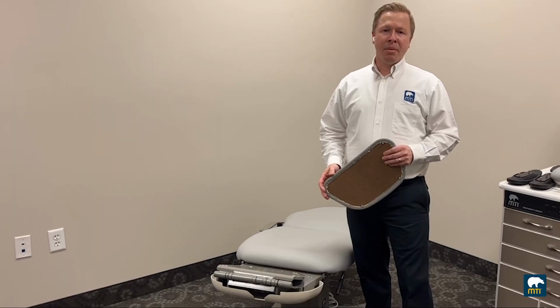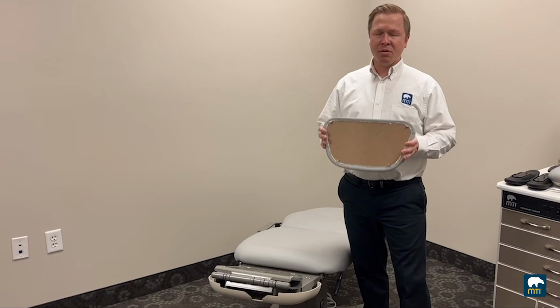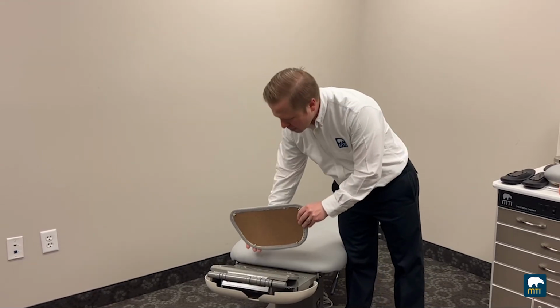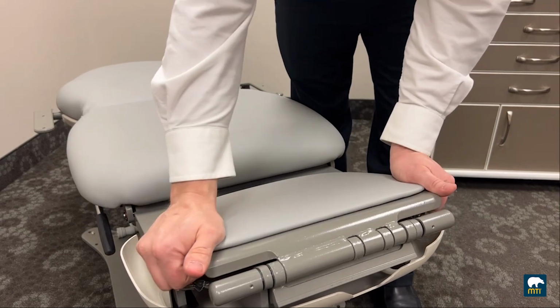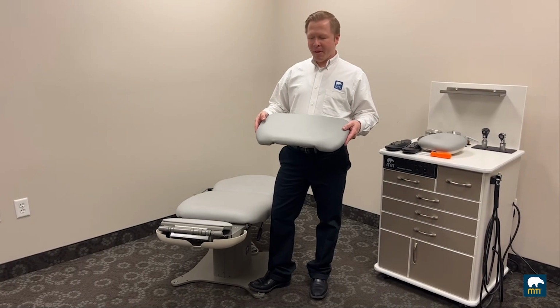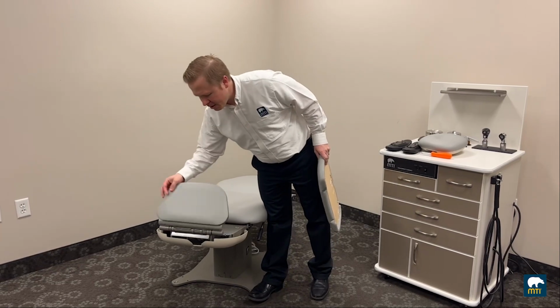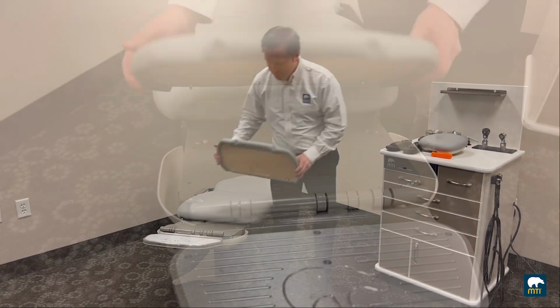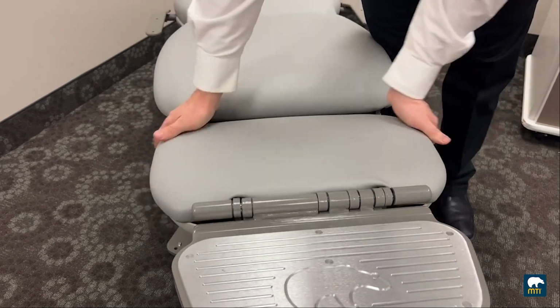Now that the seat and back upholstery are installed, the next step is to install the footrest pad. Simply line up the 4 ball studs with the 4 receptacles. The next step is to install the calf pad. First, lift up the footrest and align the 4 ball studs with the receptacles on the calf.